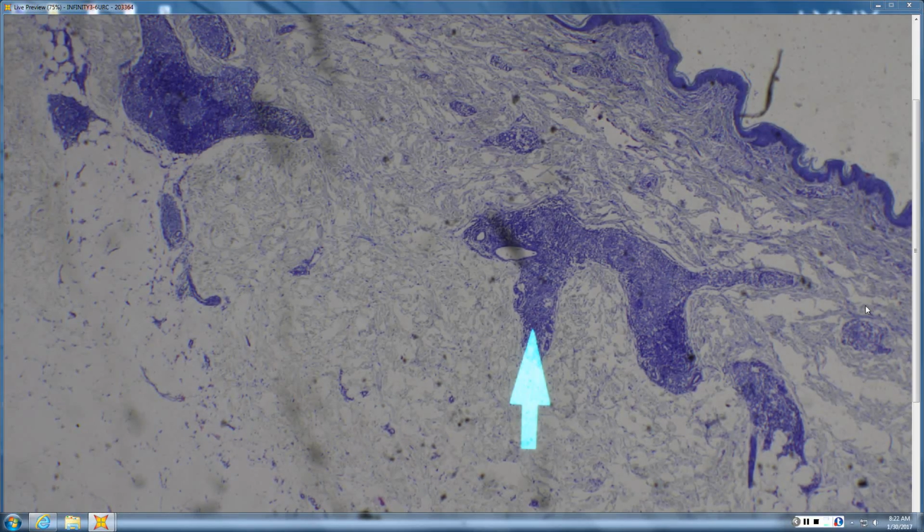Borderline leprosy is that whole group of patients who are in between. Their immune system is somewhere in between. It's not the heavy immune granulomatous response of tuberculoid. It's not the totally ineffective response of lepromatous. It's somewhere in the middle. And if there are lots of dense lymphs like that, this could actually be someone who's being treated and has a lepra-type reaction, where they are having a downgrading or reversal type reaction, which is lymphoid mediated.